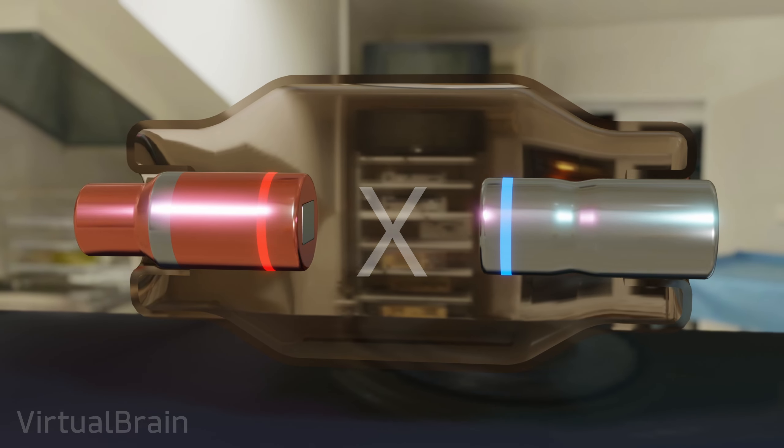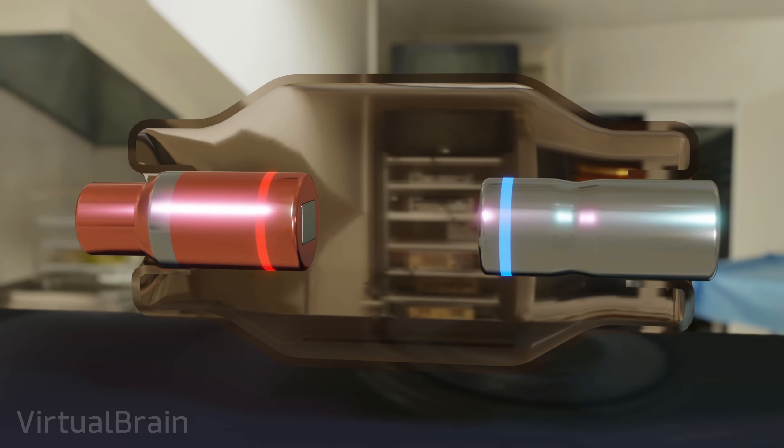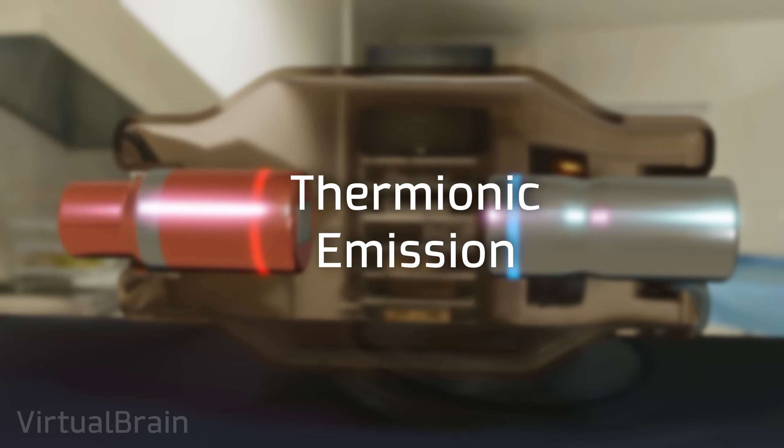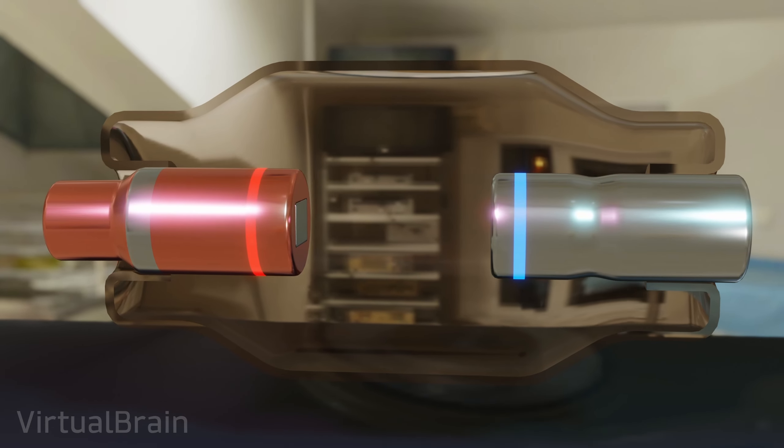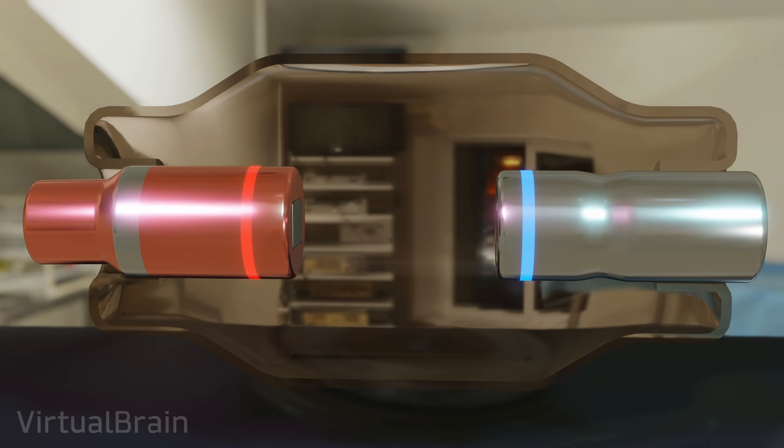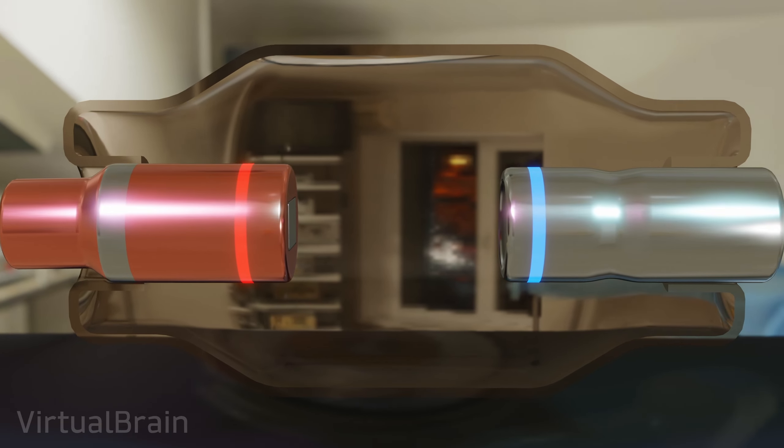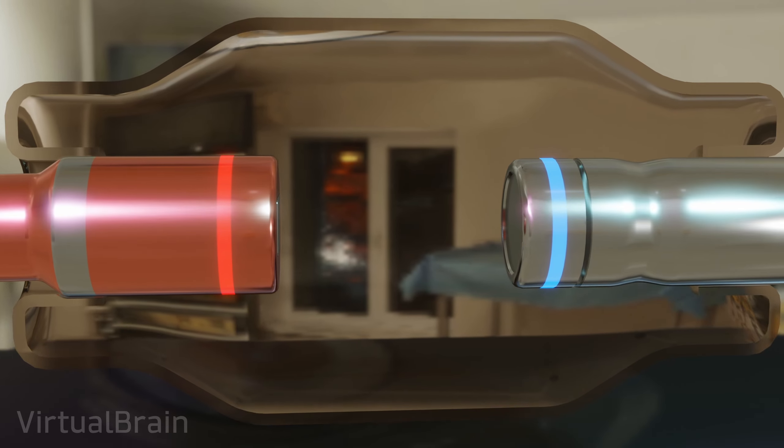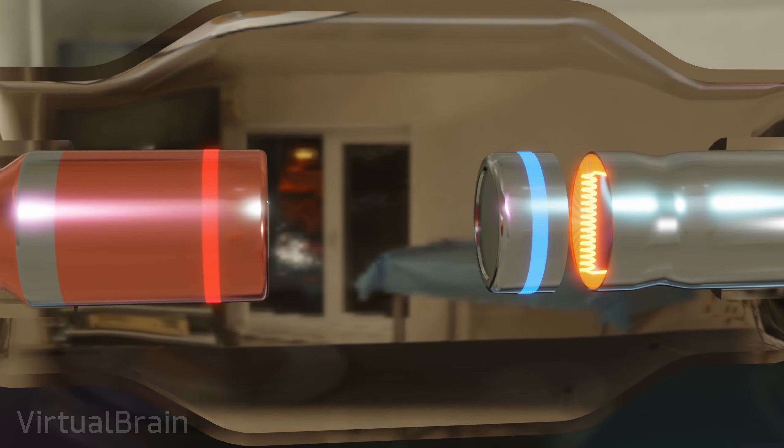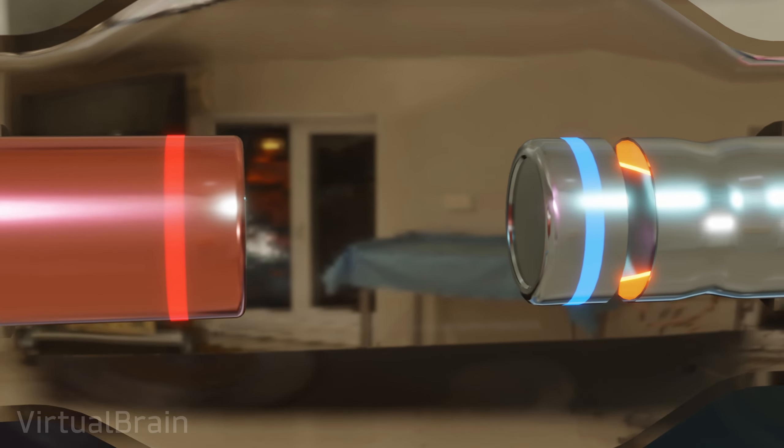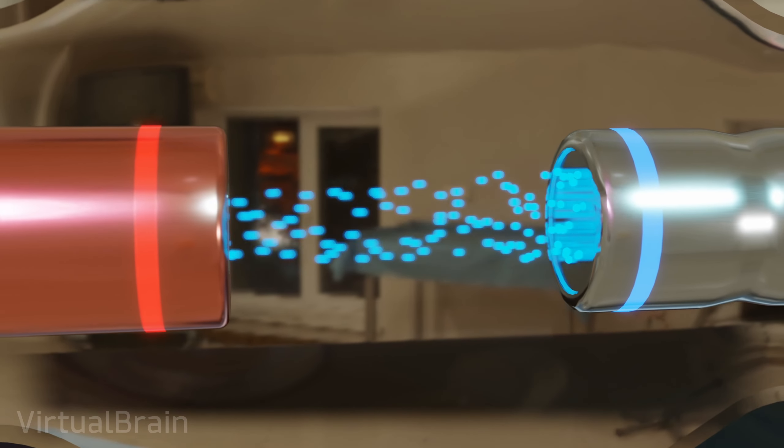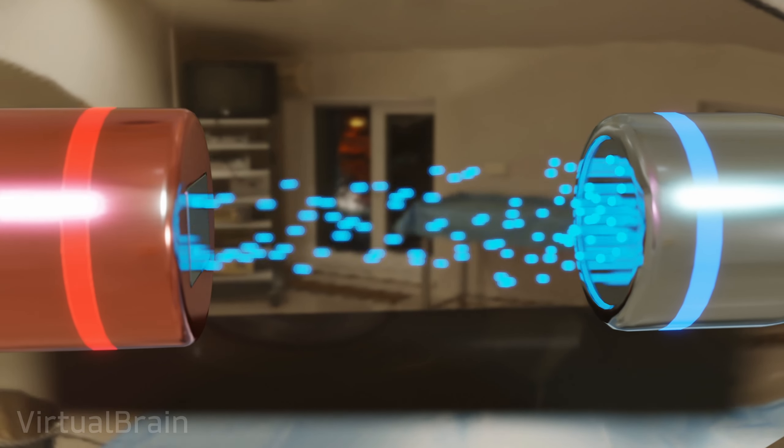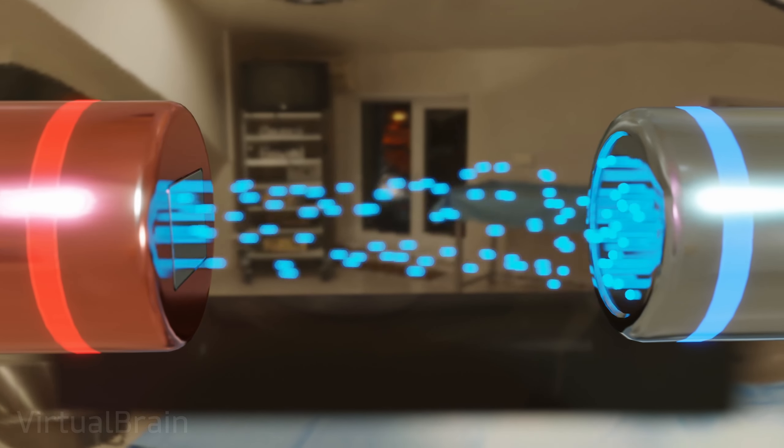To effectively make the electrons move from the cathode to the anode, an effect known as thermionic emission is used. This effect tells us that if we have a negatively charged metal and we heat it, the electrons will acquire enough energy to escape from the surface. So, by integrating a filament that is heated to high temperatures right next to the cathode, we can generate a continuous flow of free electrons. These will be instantly attracted to the anode at the other end, being accelerated by the electric field between the two electrodes.